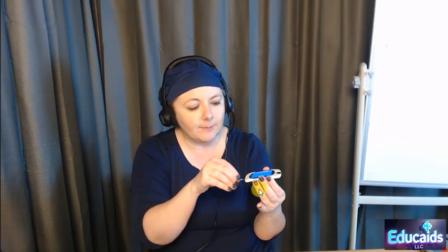And then once it's dry, you're gonna turn on your meter. Your meter will tell you when it's ready to have the strip inserted. Your strip only goes in one way. There's one end to go in the meter and one end that will accept your sample. So once the meter tells me that it's ready for me to insert the strip, I will do that. And then we have to wait a little bit, and then it will tell me that it's ready for the sample to be applied. My alcohol is completely dry now, so now we're going to get our sample.